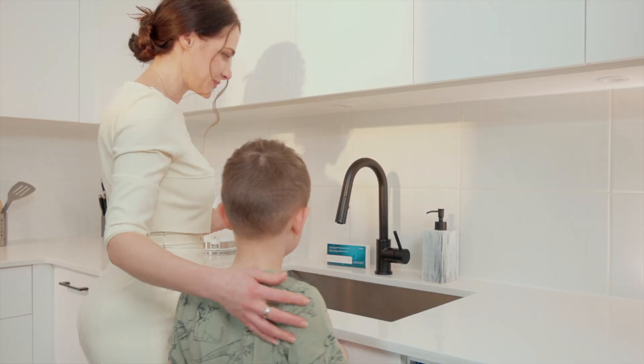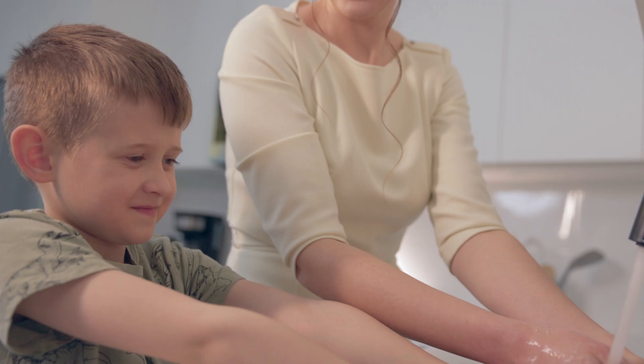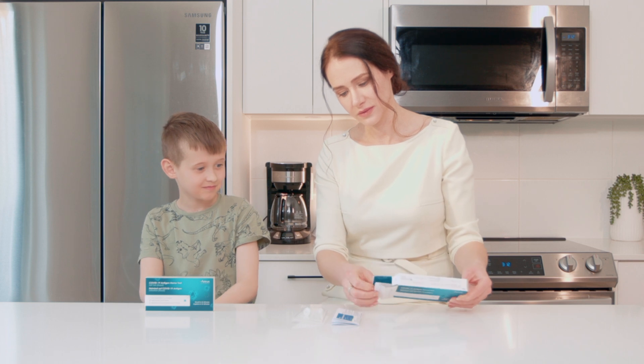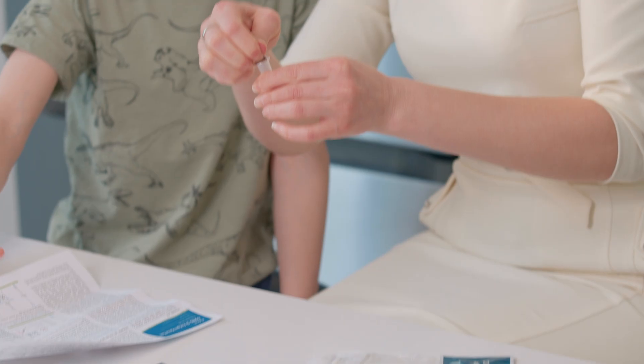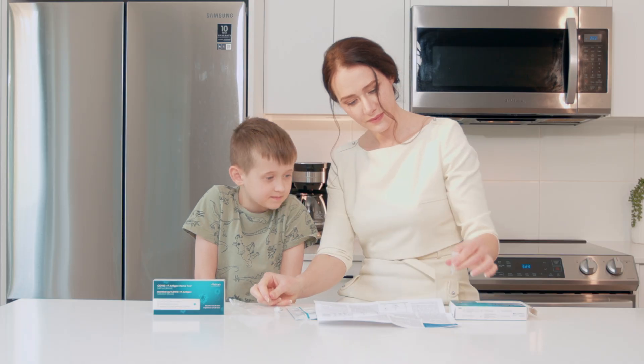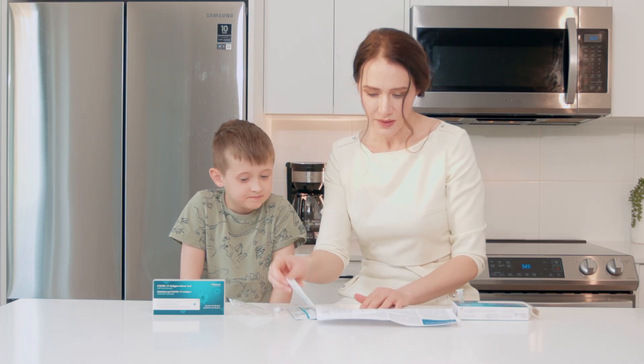First, thoroughly wash your hands with soap and water for at least 20 seconds. Tear off the aluminum foil seal from the extraction tube and place the sample extraction tube into the tube holder on the box or provided tube rack.